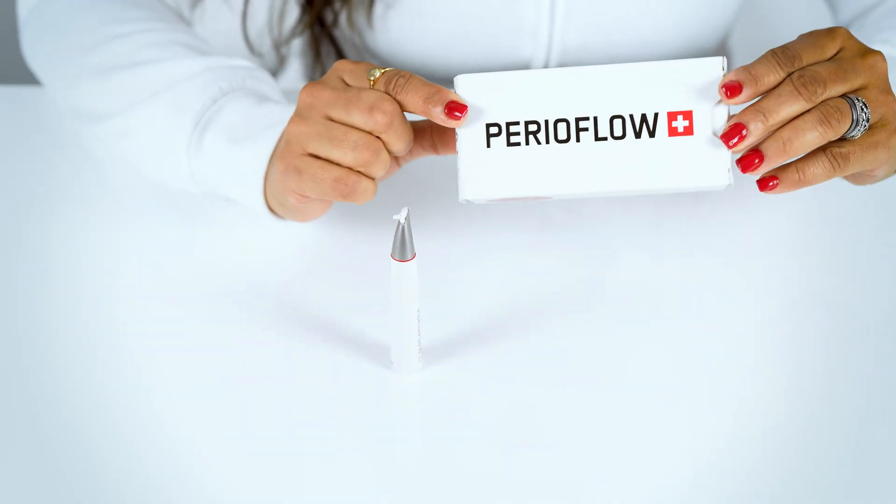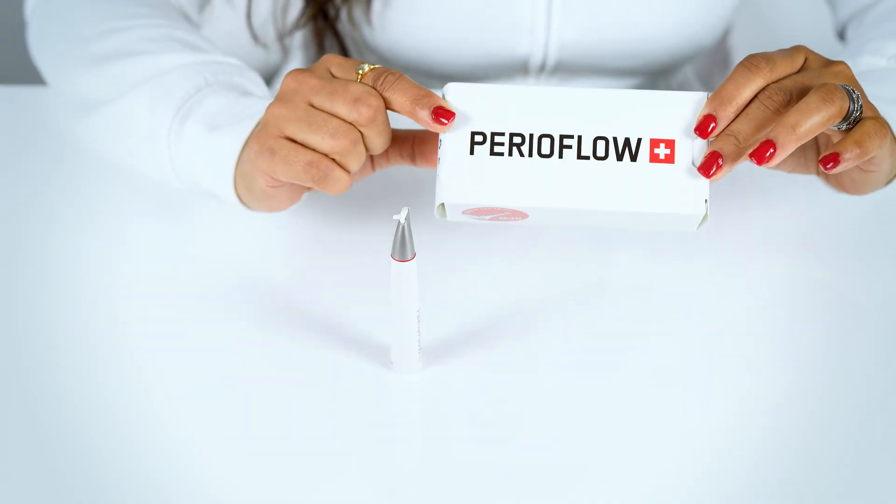This comes in a box with 40 individual nozzles. It's a one-time use disposable nozzle.